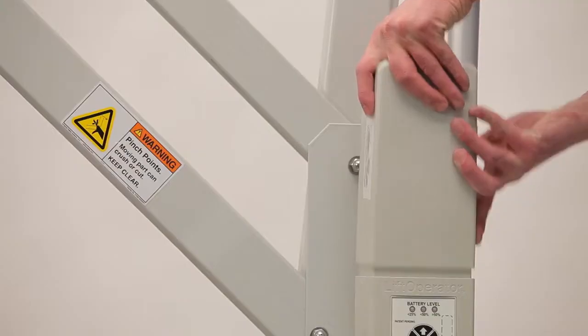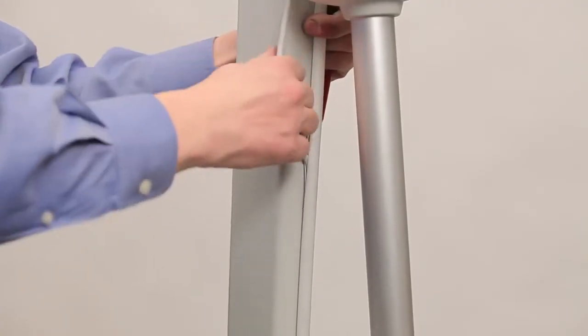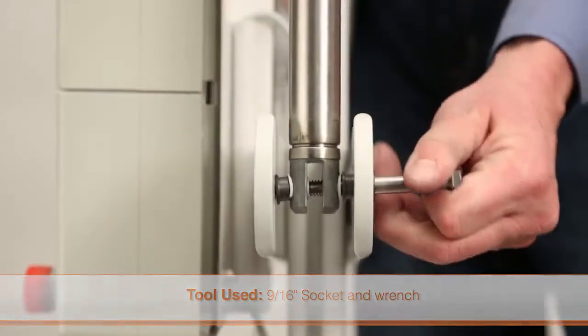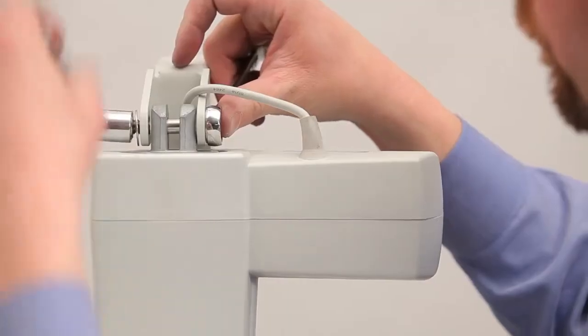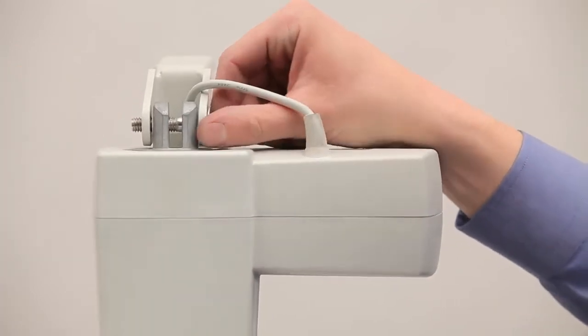To replace the actuator, remove the battery and unplug the actuator cable from the control box. Remove the cable from the cable channel along the mast. Loosen the nut at the bottom of the actuator using a wrench and remove the bolt, making sure to keep the bushings in place. Then remove the nut at the top of the actuator using a wrench and remove the bolt. Carefully remove the actuator.